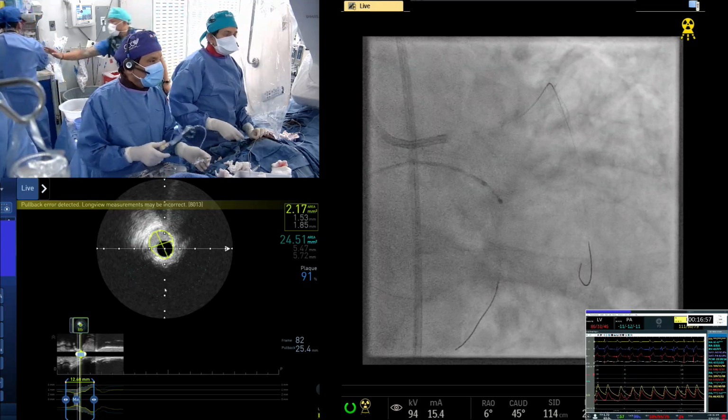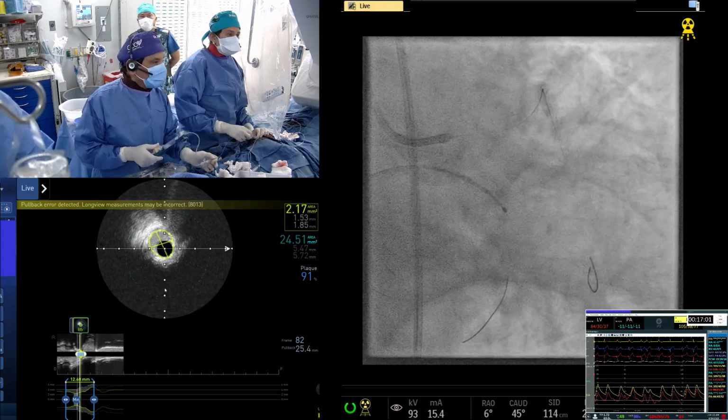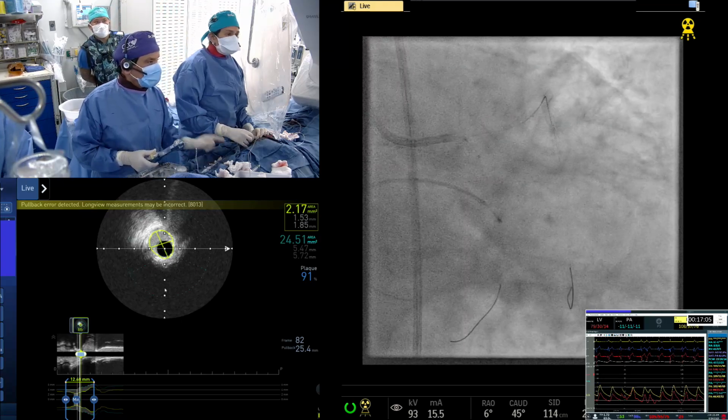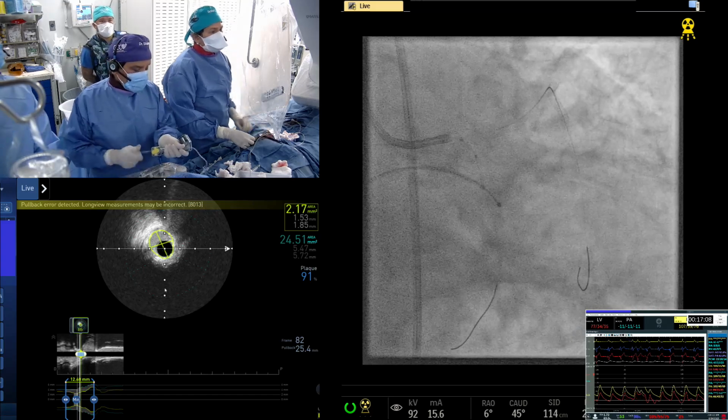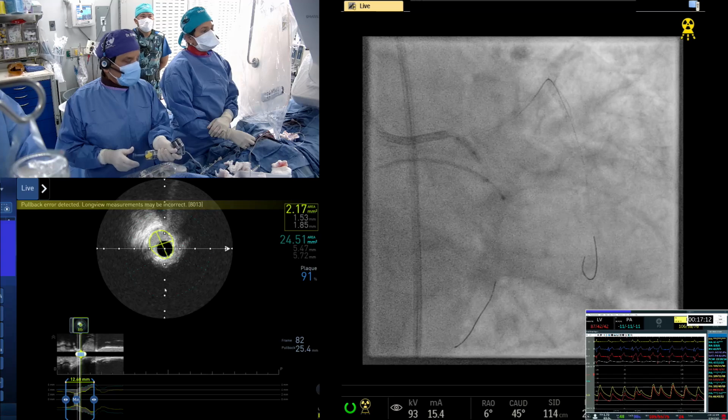Go one more, a little distal part. You said no dissection, I know, but suboptimal. Just pull back, actually. Yeah, good. Here, just low pressure. I'm not going to very high pressures here. Yeah, and just wait for a few seconds.